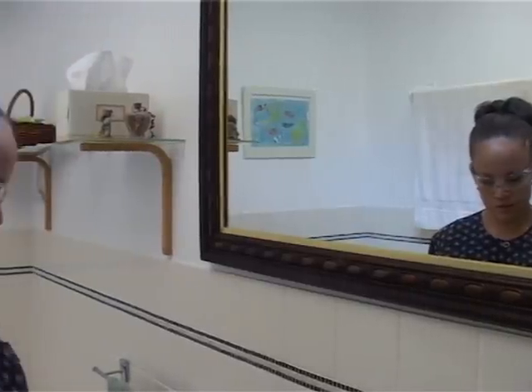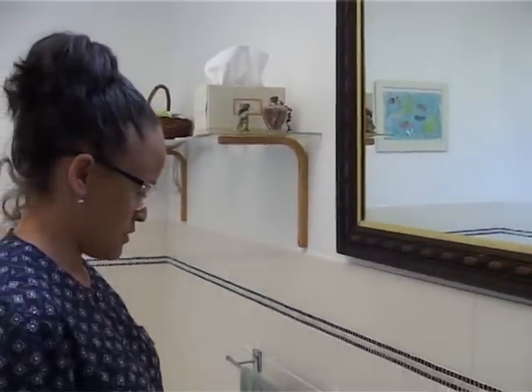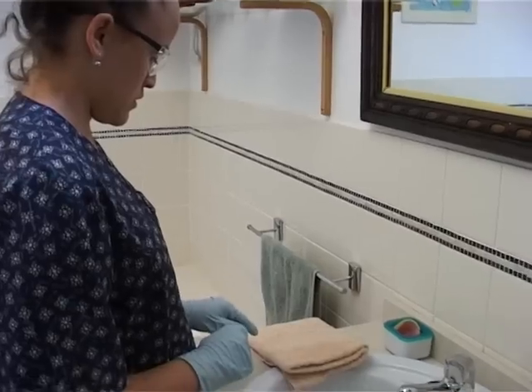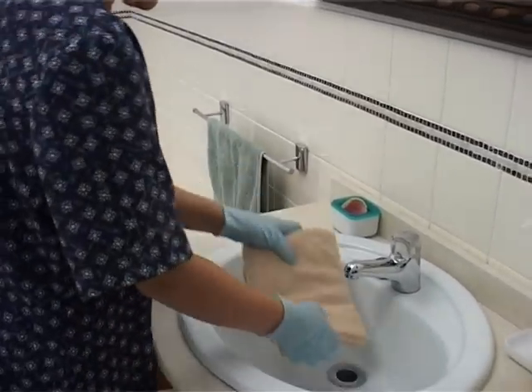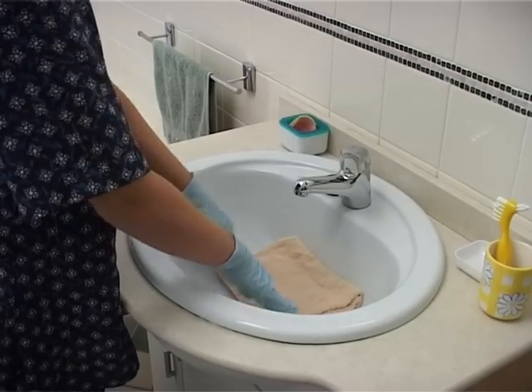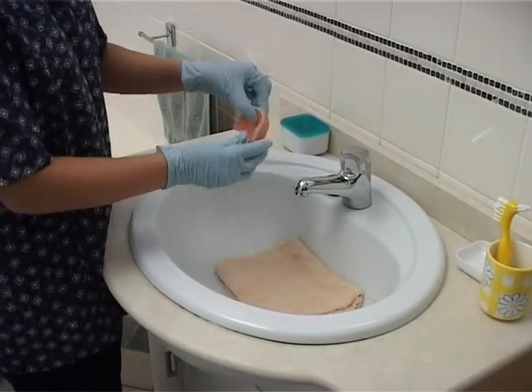Dentures can be slippery objects. If they drop onto a hard surface, they are likely to crack. Never clean them in a shower receptacle where they could easily fall onto a tiled floor. If you are cleaning them over a porcelain basin, put a face washer or some water in the basin.